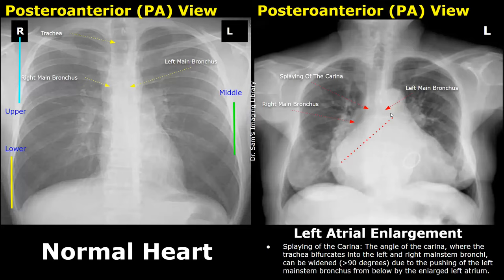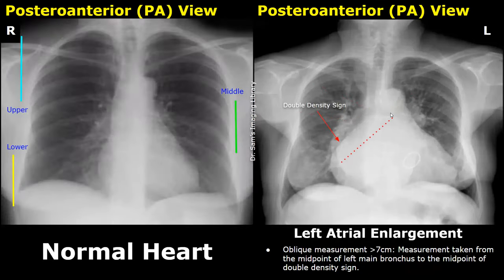Another feature is an oblique measurement taken from the midpoint of the left main bronchus to the midpoint of the double density sign. This measurement will be greater than seven centimeters in cases of significant left atrial enlargement.